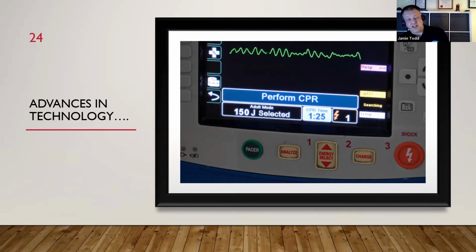So actually the 2-minute cycles could even go, where the machine is looking at the shockable rhythms and going, not yet, not yet, not yet, now. Yeah, and sort of interpreting where we want to deliver the shock. So yeah, this is pretty fast, and it's so fast in getting to a shockable state in 3.6 seconds, you don't even have time to go back on the chest to do CPR. Because by the time you press analyze, it's ready to shock so fast.